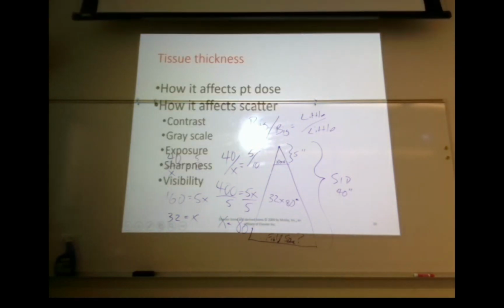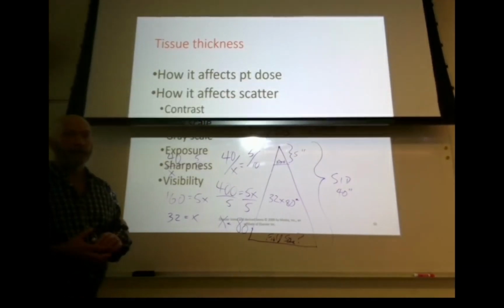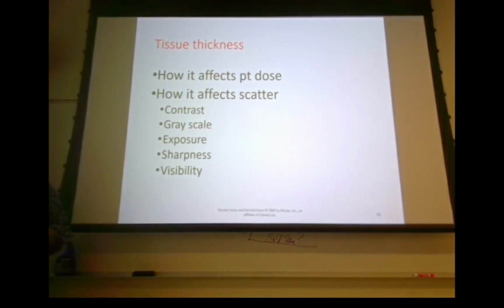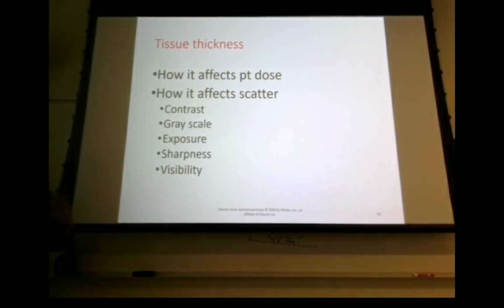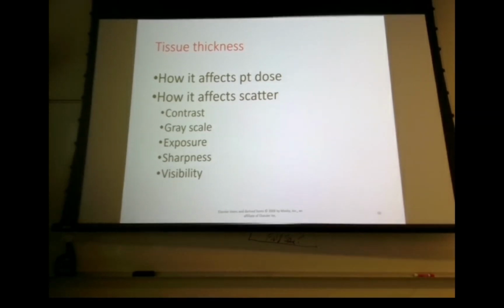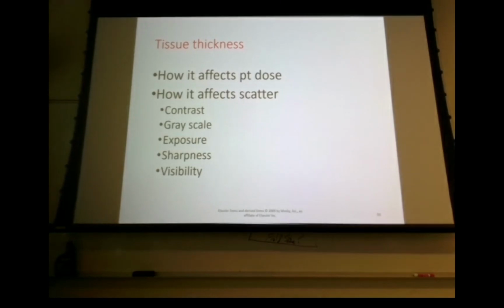So could you give an example of a question where the answer would be only one of the numbers? The only time that it would just be one would be if it was a round diaphragm opening. So, you may have a question that says, a round diaphragm opening is 5 inches below the target, then it'd just be one measurement instead of 2. So rectangular openings are typically gonna be 2.